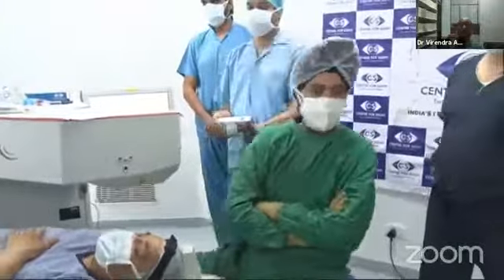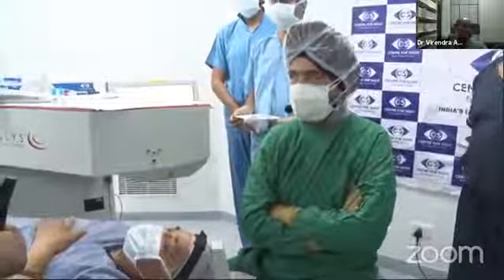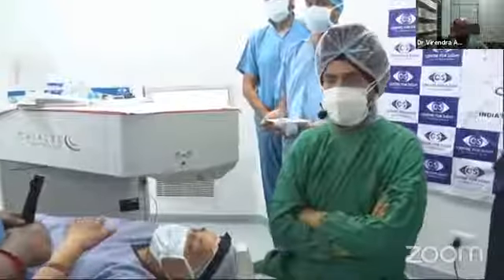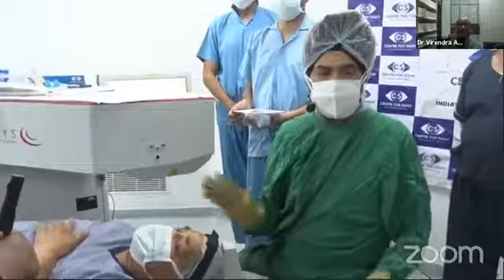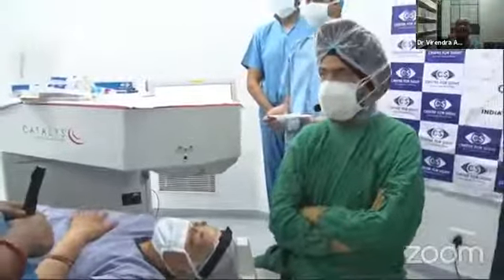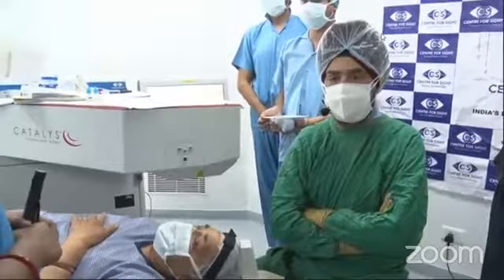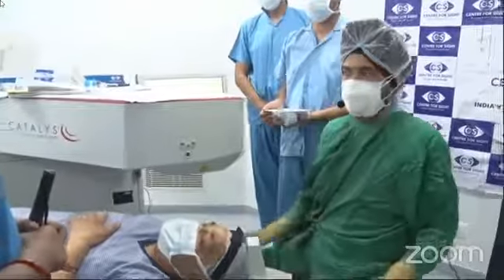Welcome to Center for Sight. Thank you very much DOS for having afforded this opportunity. We have lined up three cases — two of them femtolaser assisted cataract surgery and one will be an MICS procedure. I'll be doing this lady, a 73-year-old who has a grade 3 cataract, and we are planning to do a femtolaser assisted cataract surgery along with implantation of the newly introduced continuous range of vision implant, the CRV.